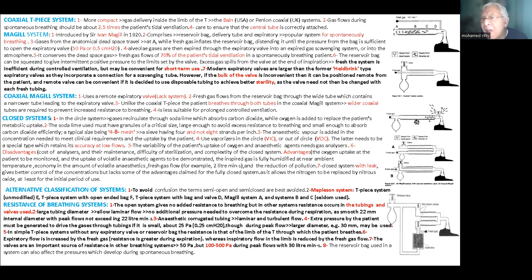So we have a part of the expiration, which is the tidal volume, where we have less CO2 and more oxygen, so that whenever the patient is required to have less than his own tidal volume, he can take this from the remaining tidal volume present in the expiratory limb when all the alveolar gas has been expelled from the expiratory valve.